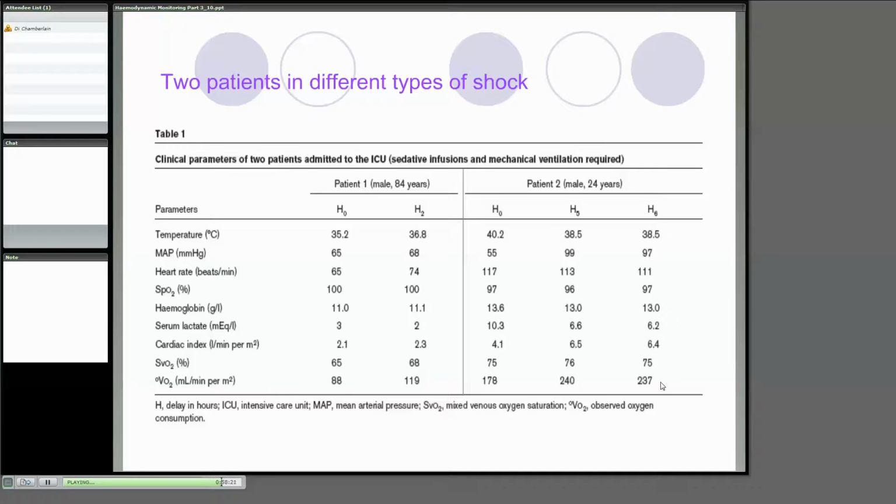Okay, so tell me, what are we looking at? We're looking at MAPs and heartbeat. MAPs, okay. Yeah. No? MAPs a bit low? Yeah? He might be on beta blockers. We really don't know with this guy. Cardiac index is a bit sluggish too, isn't it? Yeah. So he probably does have hypoperfusion, but it's one of those ones that's sort of insidious. So where do you think we'd send him to or have done with this chap?